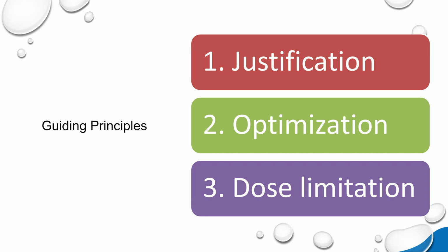So it means that if your clinical exam doesn't give you all the information that you need to do the proper treatment plan, or to assess if you're looking, for example, for a root fracture, or if you're looking for something very specific, are you seeing this in your clinical exam, or you don't? So you're then justified to take some more information, which most likely are going to be furthermore radiographical examinations.